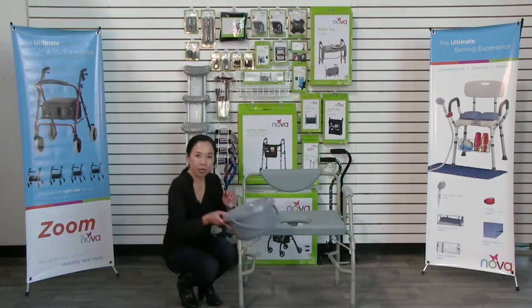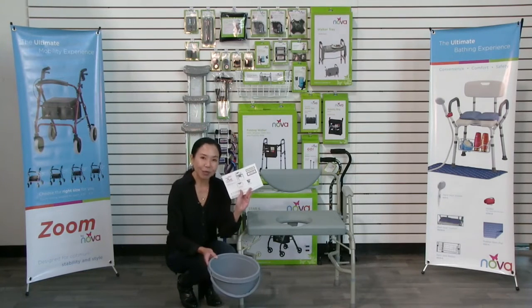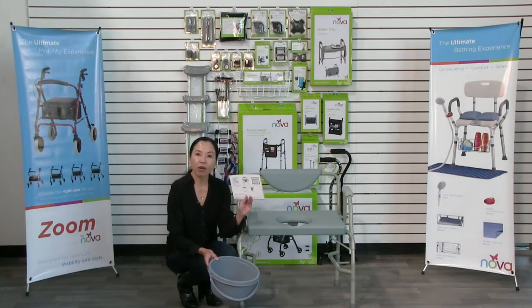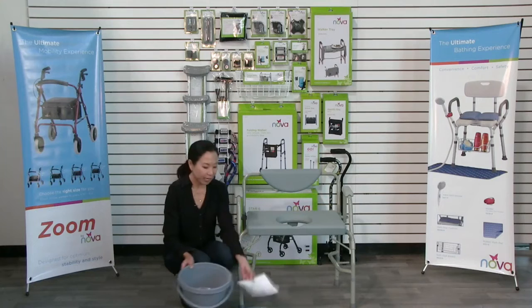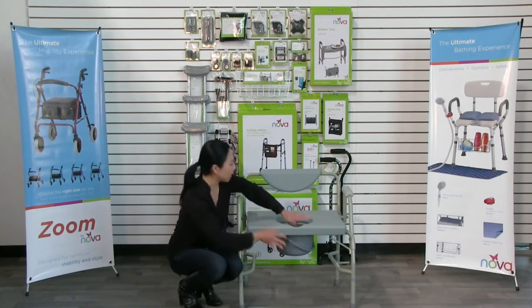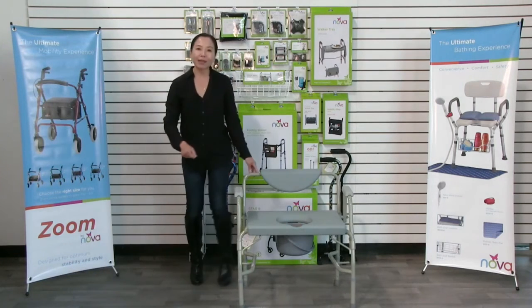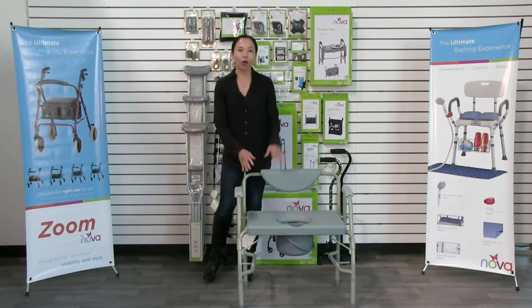Now using the commode pail — we have the instructions right inside the commode pail, so you can reference this for care, use, warranty, and contact information. The bucket just slides under here just like that, and then you can use it as a commode. That is the heavy duty Nova drop arm commode.